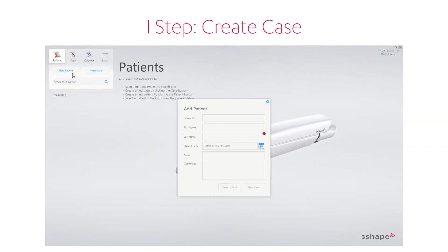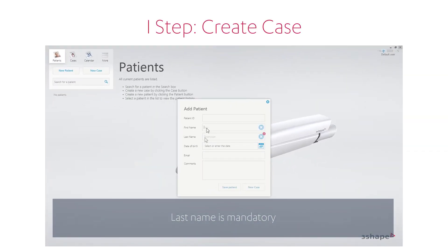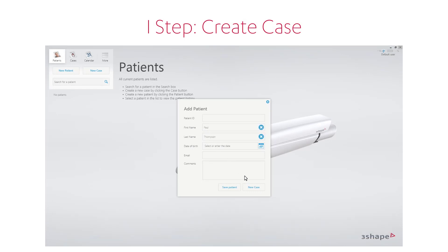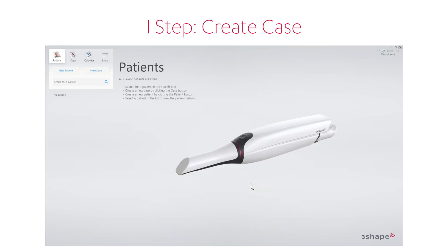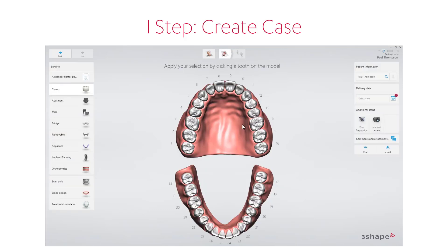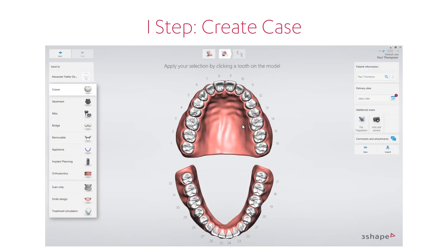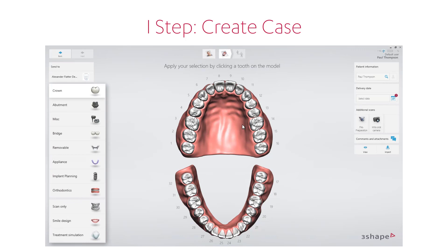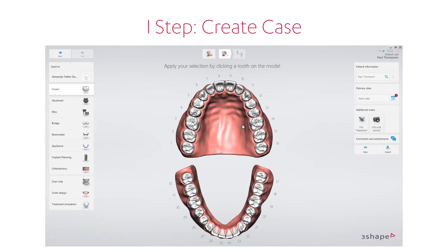The first step is to create the case you want to scan for. You start with setting the patient's personal data. Once the patient has been added, you'll then choose the lab or manufacturer with which you wish to work. After choosing the lab, you will enter the order page, where you will select the tooth or teeth on which treatment is planned.